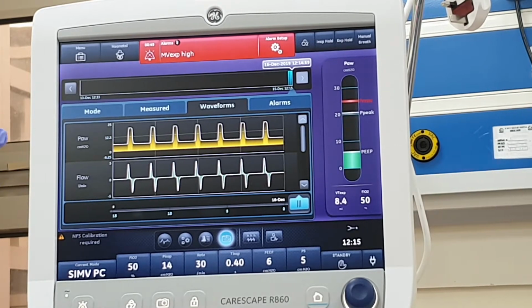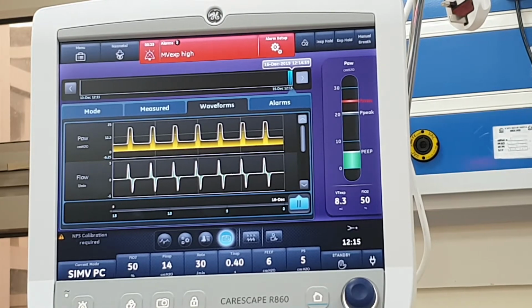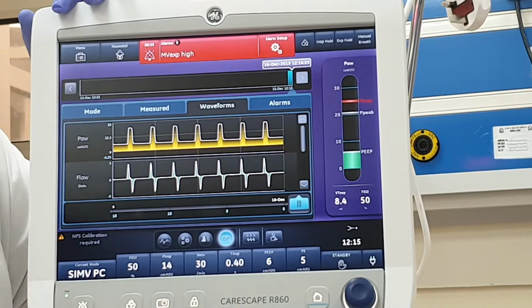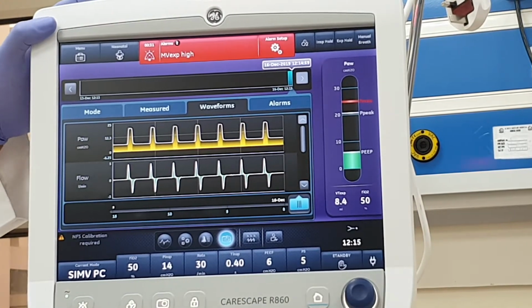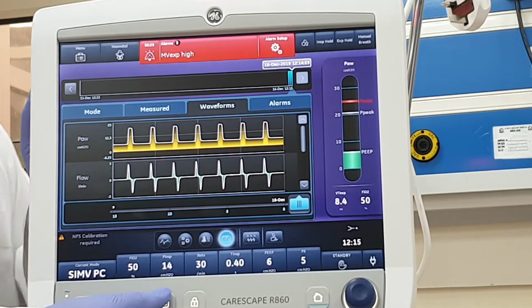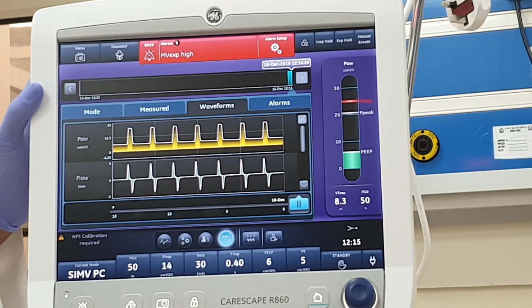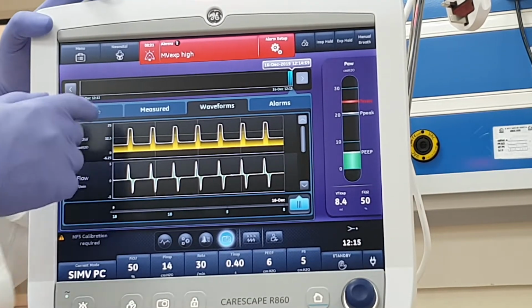But you could tell Mishari, hey Mishari, you told us that we have already 72 hours of everything. Why do we need a screenshot? So screenshots is something additional. Let's say something happened to the patient, you don't know what's happening and you want to do a screenshot until the doctors or the RT comes and figure out what's going on. It can be very helpful.